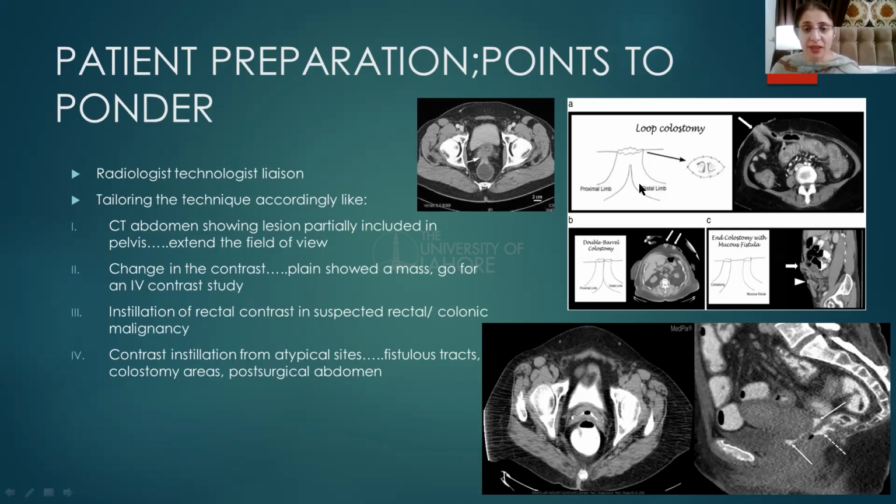And many times the radiologist is not available at hand, so the responsibility lies on the technician. And I believe in that case, the technician should be intelligent enough, experienced enough to alter and tailor the technique in the benefit of the patient to acquire the maximum result. So I have explained a few examples just to elucidate my point.